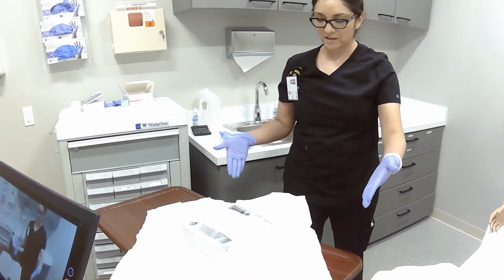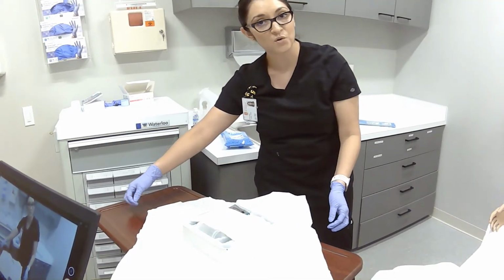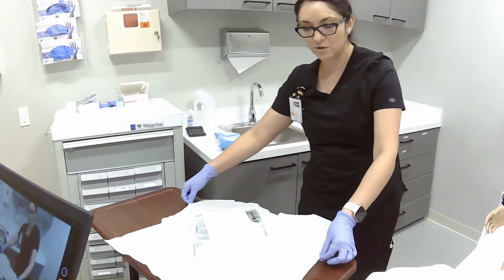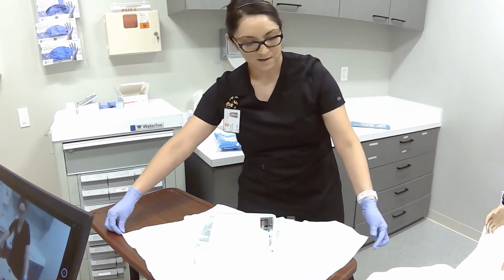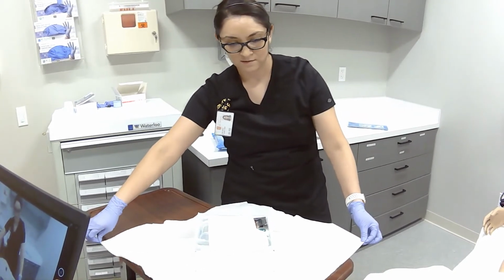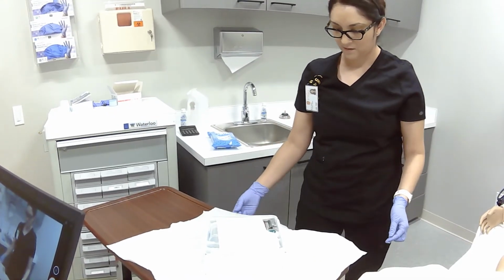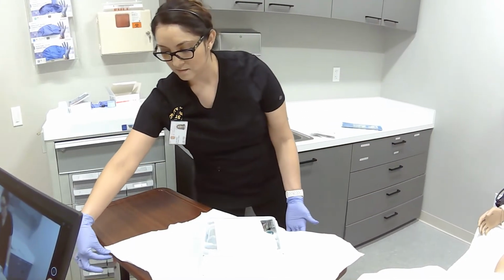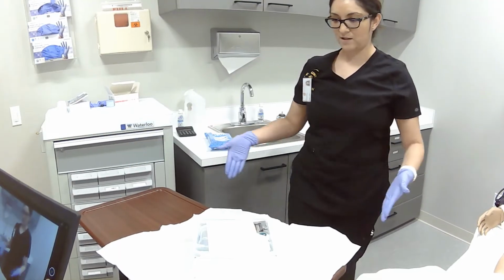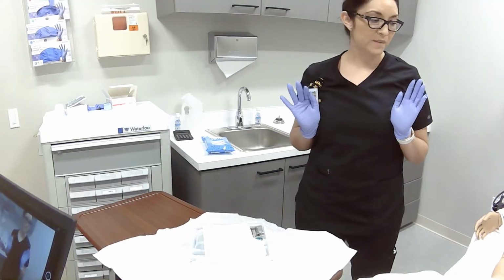So it's going to be in a diamond shape, so I am going to carefully, by only touching the 1-inch margins, which are considered not sterile, I'm going to adjust this, making sure that I'm not reaching over my sterile field. Okay. And adjusting it so your drape kind of makes a rectangular shape, or more of a square shape, okay?